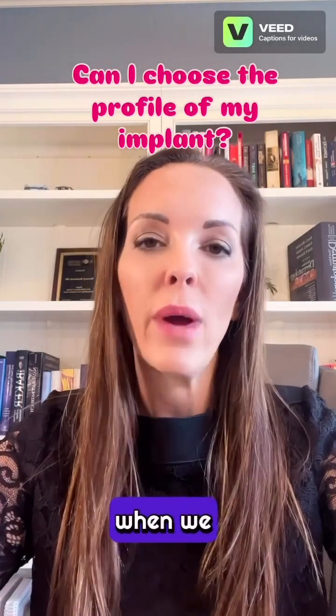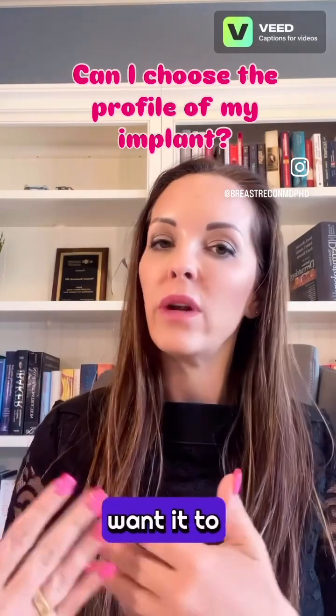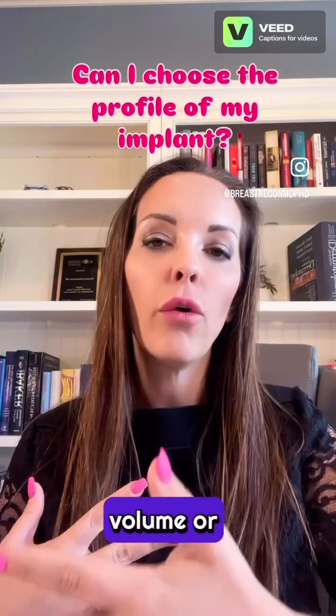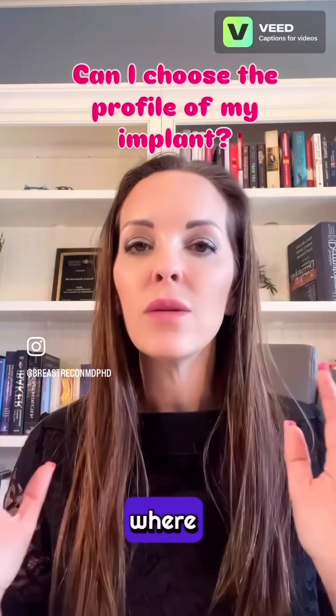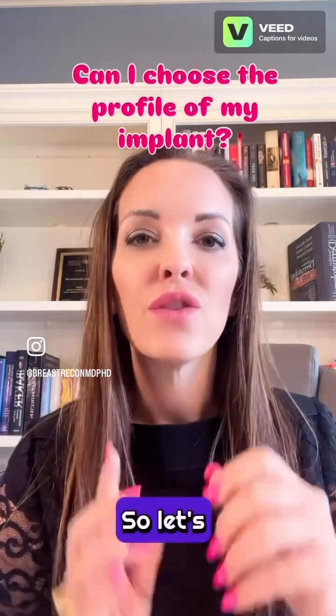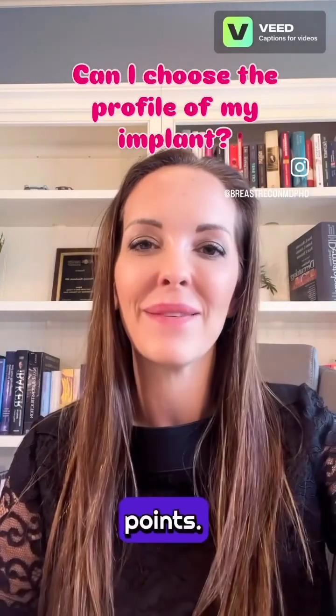So once again, when we choose our implant, we look at your breast width because we want it to be as wide as your breast should be. We look at then the volume or projection. And this is where implant manufacturers, I think, were literally just trying to confuse us. So let's take a look at Allergan's size chart to help explain my points.